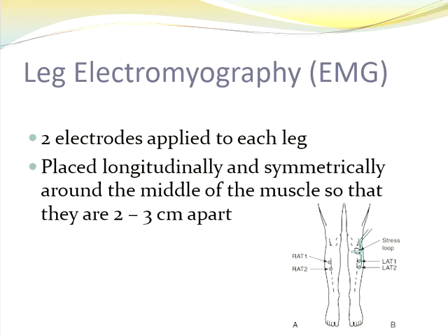The stickers that come in your kit will kind of dictate how close they can be, because those are really big stickers. So you want them trying to be about right in the middle of the muscle, so middle of the leg, not too close to the knee, not too close to the ankle, right in the middle of the leg, right in the middle of the muscle. And then you're going to put them on.